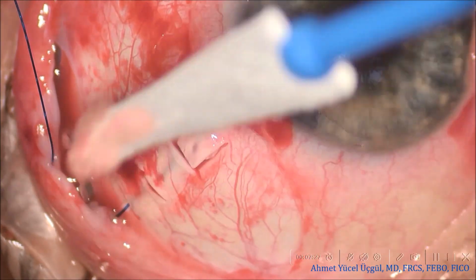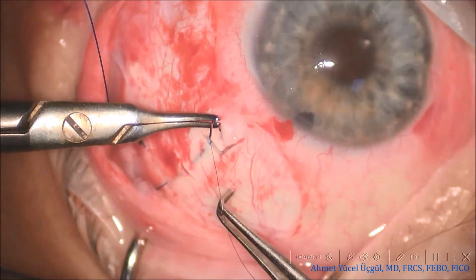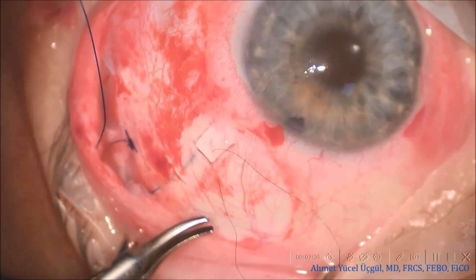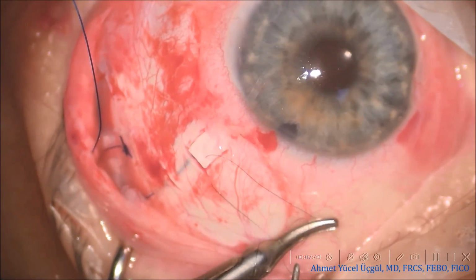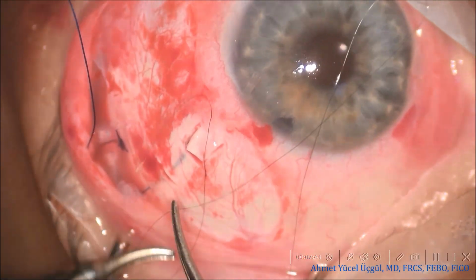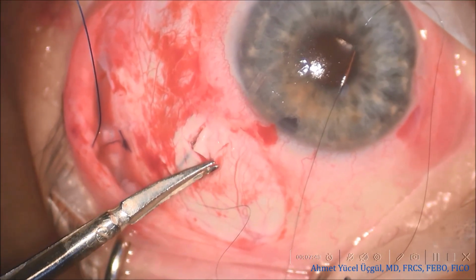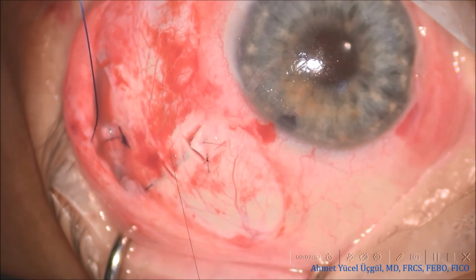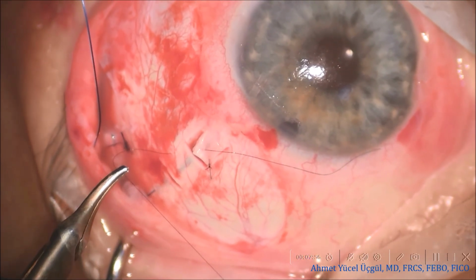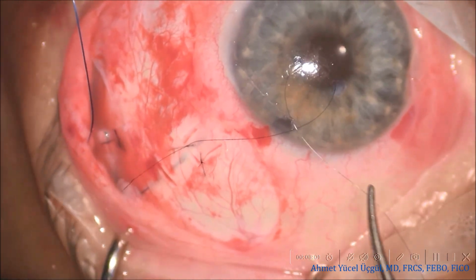The scleral flap is then secured to the recipient bed with two 10-0 nylon sutures. At this stage, I prefer to take a shorter bite from the flap and a longer bite from the recipient bed. This improves wound edge apposition and also makes it easier to bury the sutures. Once the flap is closed, the thin tube remains completely within the intrascleral space. I consider this a protective approach as it helps reduce the risks of tube erosion, peritubular leakage, and post-operative endophthalmitis.